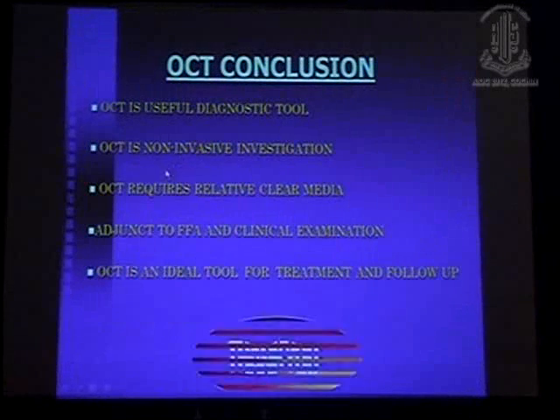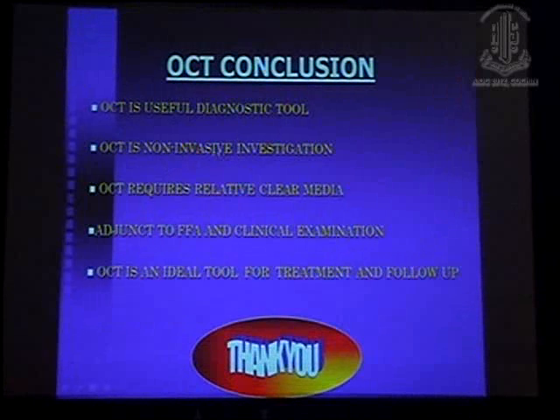So in conclusion, I would like to say that OCT is a very useful diagnostic tool. It's a non-invasive investigative tool. OCT requires relatively clear media, and it is an adjunct to FFA and clinical examination. But many a time it helps detect things which may not be picked up on the FA and ICG. And OCT is an ideal tool for treatment and follow-up.